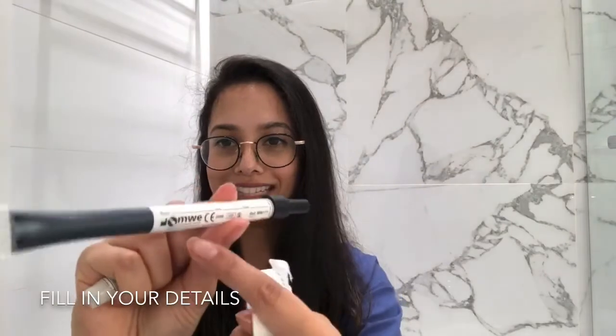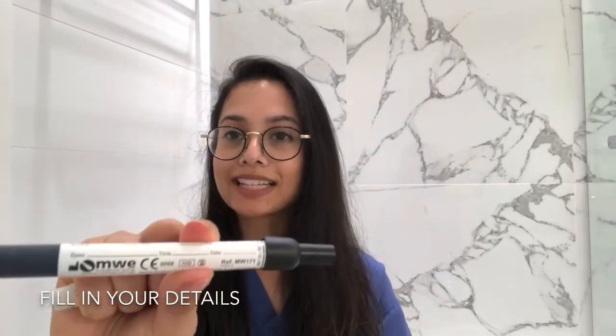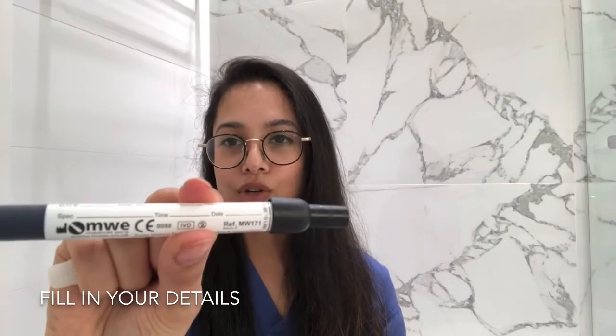Make sure you fill in the details on here, or attach a sticky label that you may be given by your doctor.